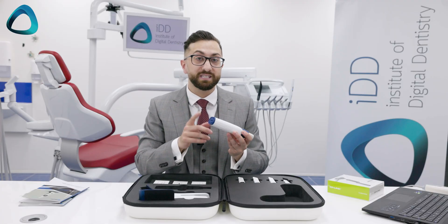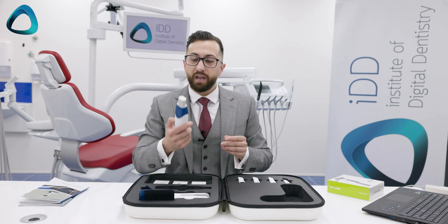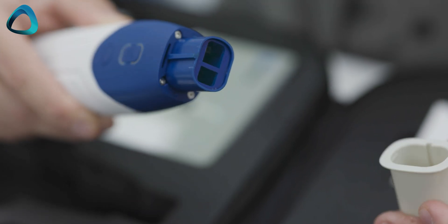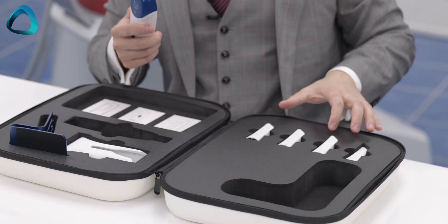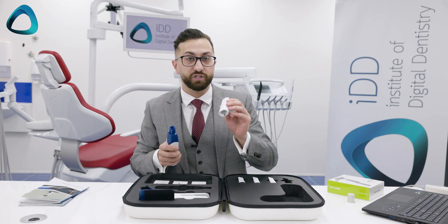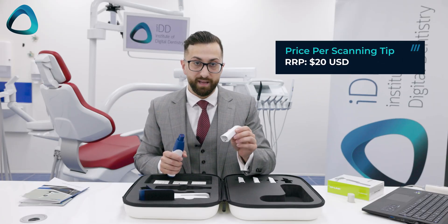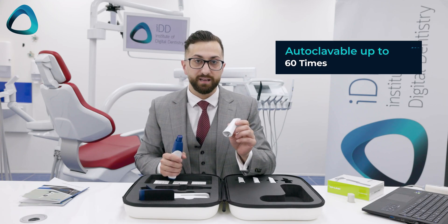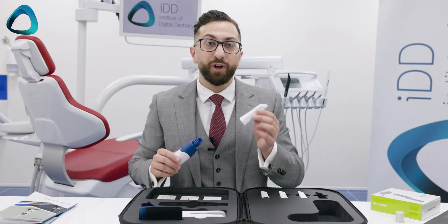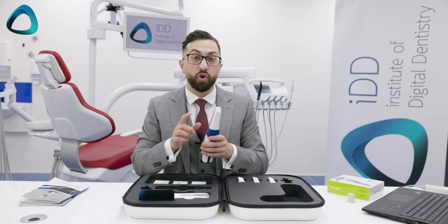We also have two indicators here. One indicator tells you how much battery is left, because as I mentioned this is a wireless scanner, and you have the connection status indicator as well. Just like the previous generation scanner, you have a protective cap, and with the scanner you get four scanning tips. The company tells me these are the exact same scanning tips as the previous generation — just a different color. These scanning tips cost $20 USD per tip and can be autoclaved up to 60 times, which works out to about 33 cents per patient. These scanning tips can only be put on one way, so this is not a reversible scanning tip.